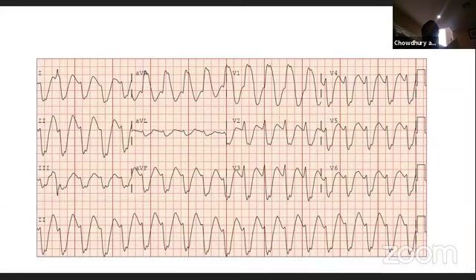And that problem, unless we recognize it by the EKG, because EKG and chest X-ray are the immediate tools that we have in the hospital. If we are not very good at this, sometimes we miss the diagnosis. And in our hospital, there is another problem now that the stat lab is coming late because the glucose is sometimes so high, the lab does not release the electrolytes because of the sodium issues. They delay the reporting of the potassium, and I am telling the lab to please report the potassium early on. But in any case, we should be able to recognize the hyperkalemia and understand this issue so we can take care of the patient.